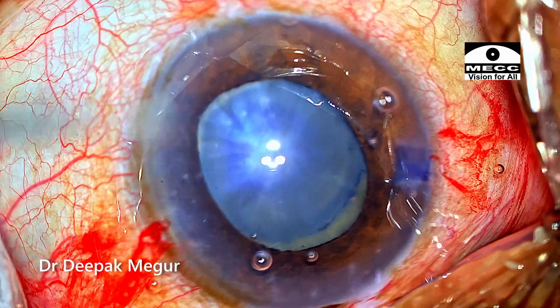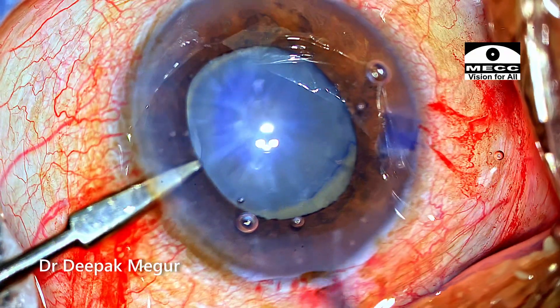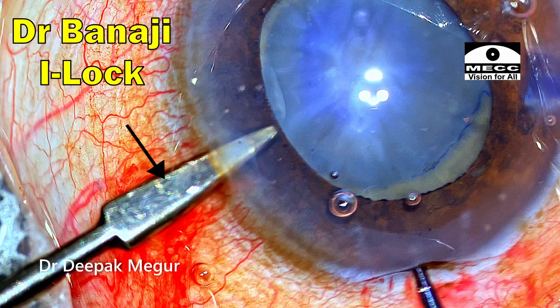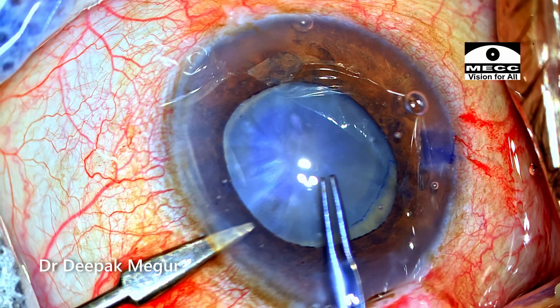To prevent the globe from turning away, I prefer to stabilize the eye using a second instrument. I am using an instrument called the Banaji's eye lock, designed by Dr. Banaji, which helps me to stabilize the globe better when I am trying to perform the rhexis.